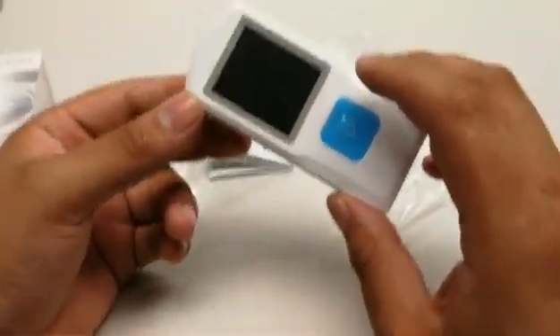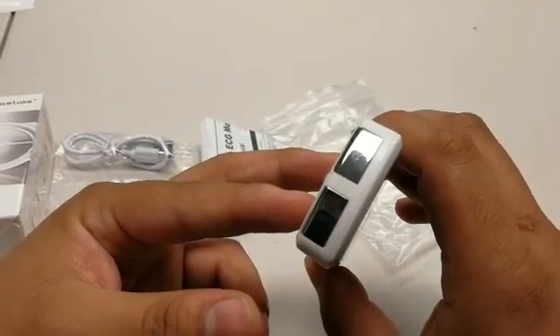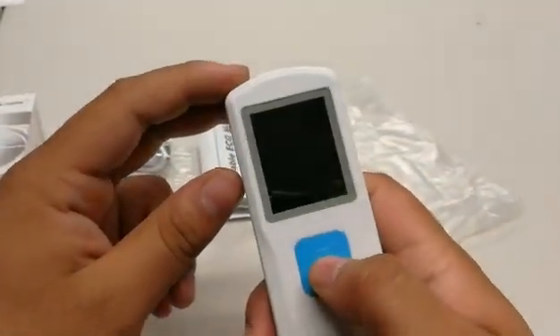To get started with this item, please remember when attempting to get a reading, cover the metal leads at the end of the unit, as without doing this it may lead to an inaccurate reading.